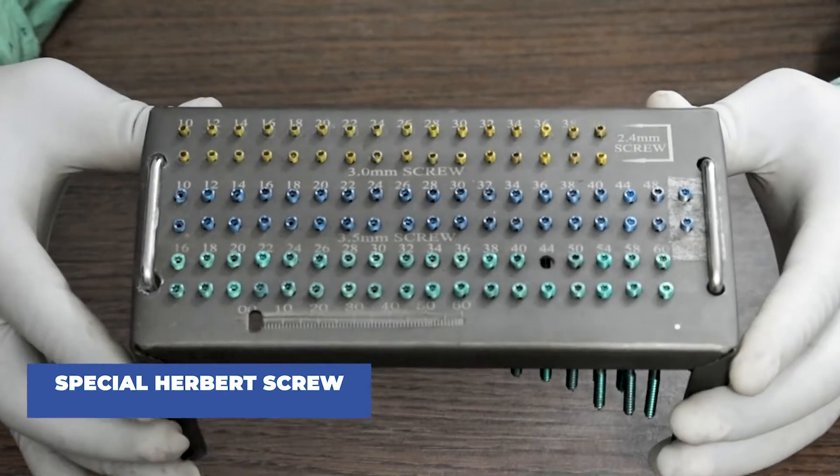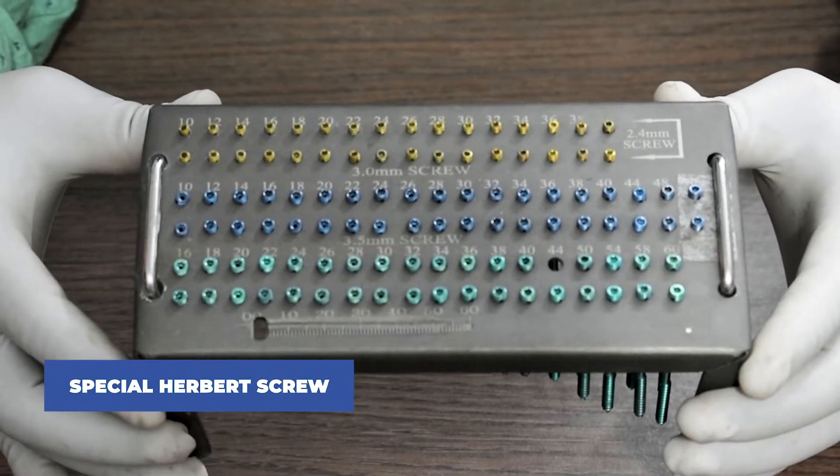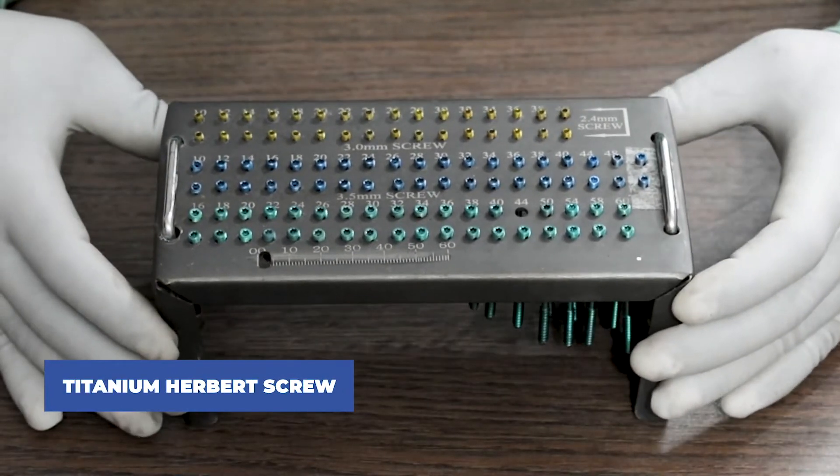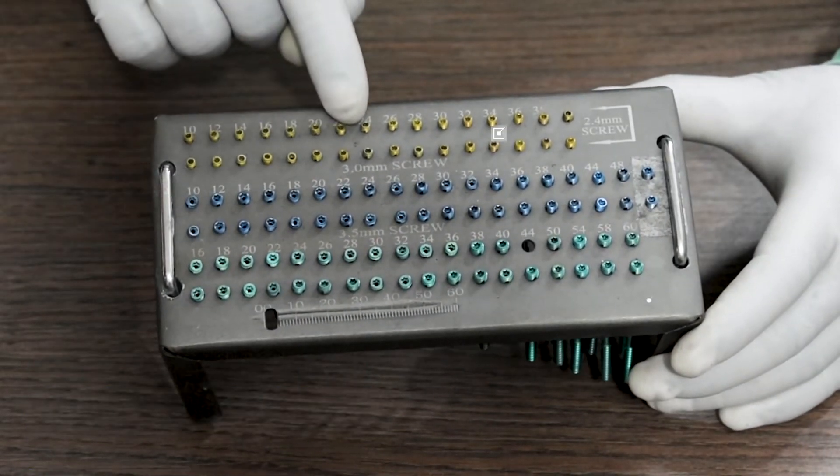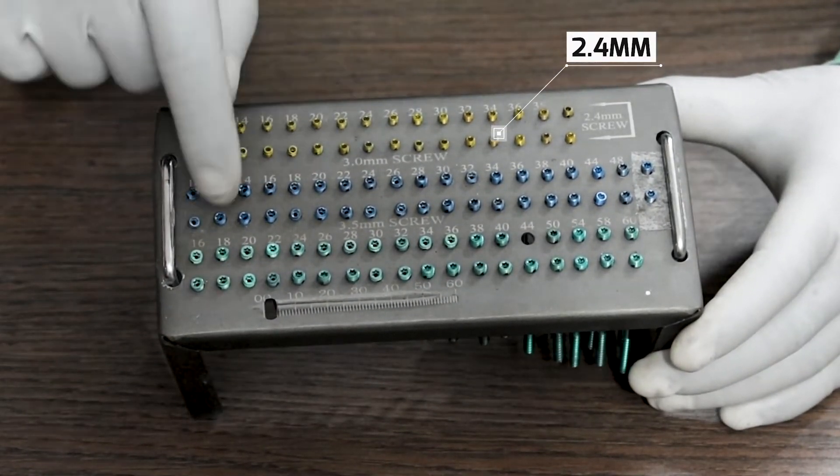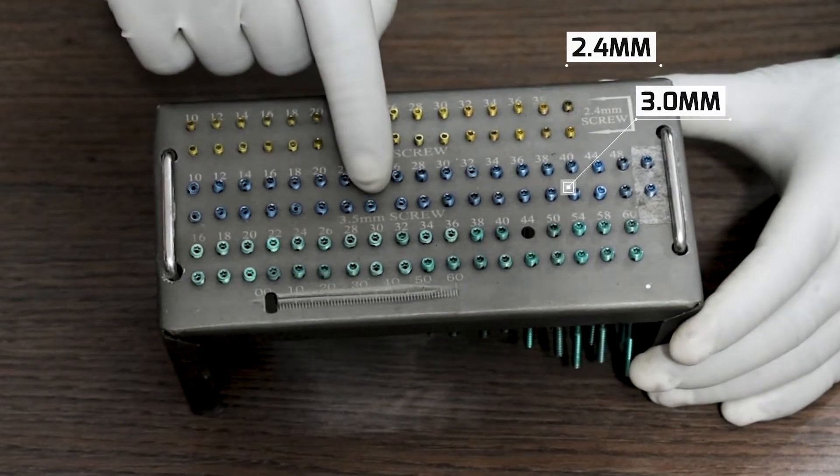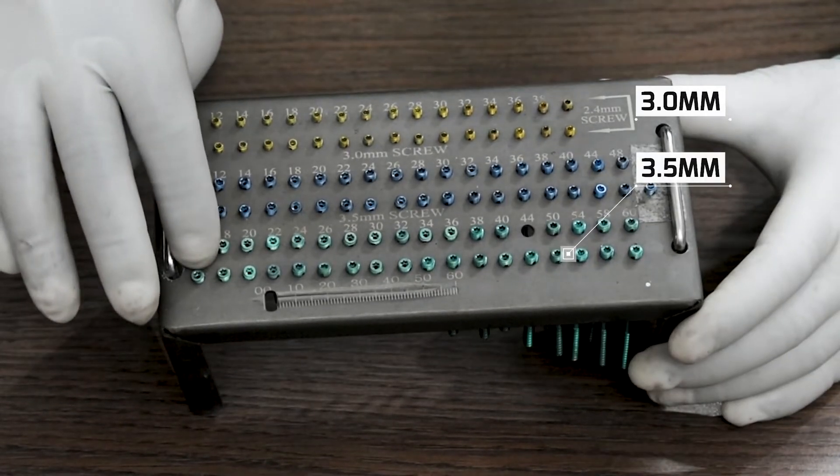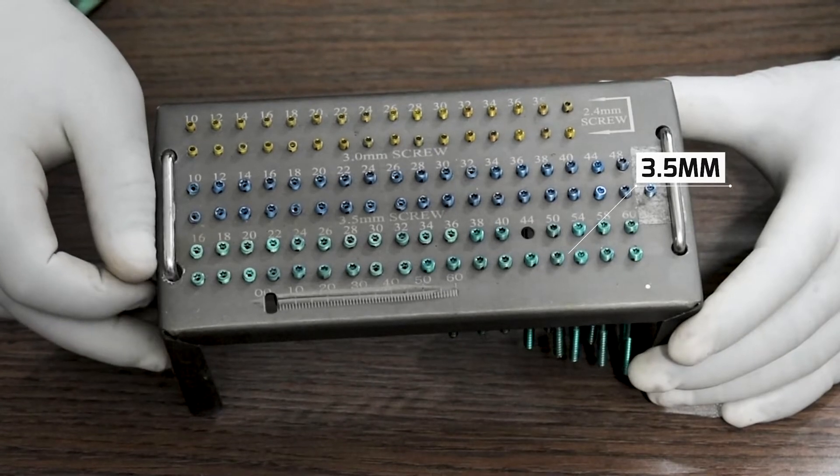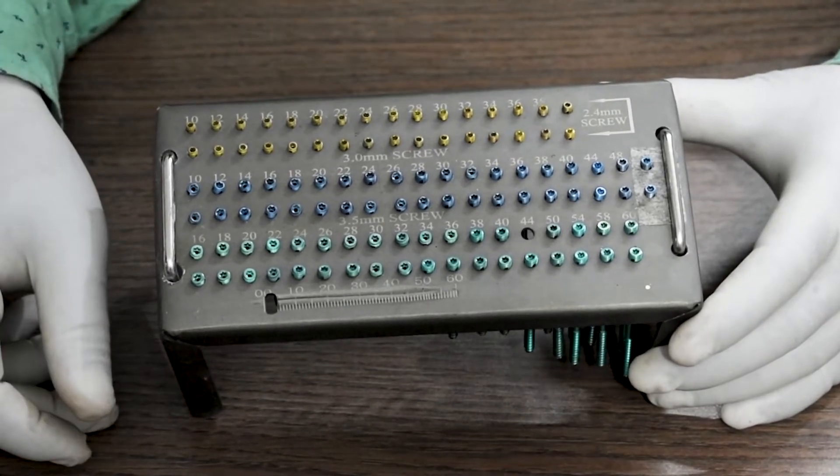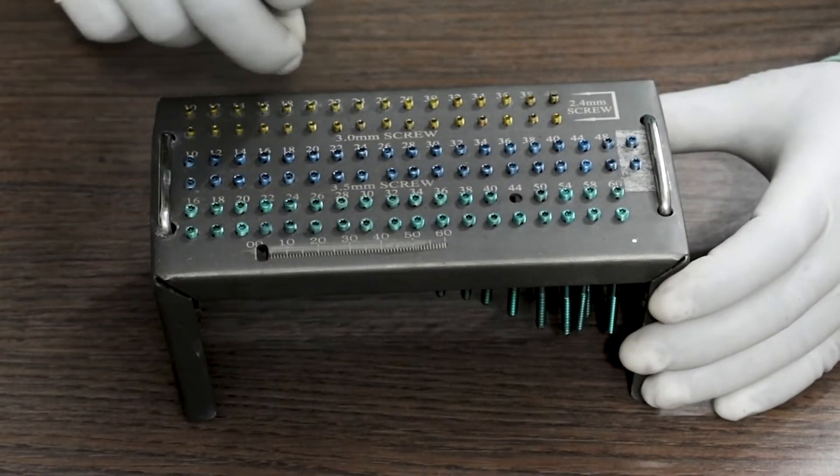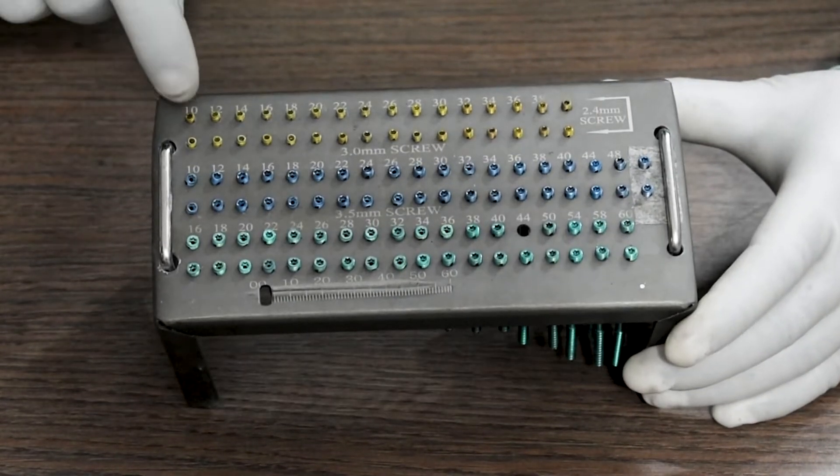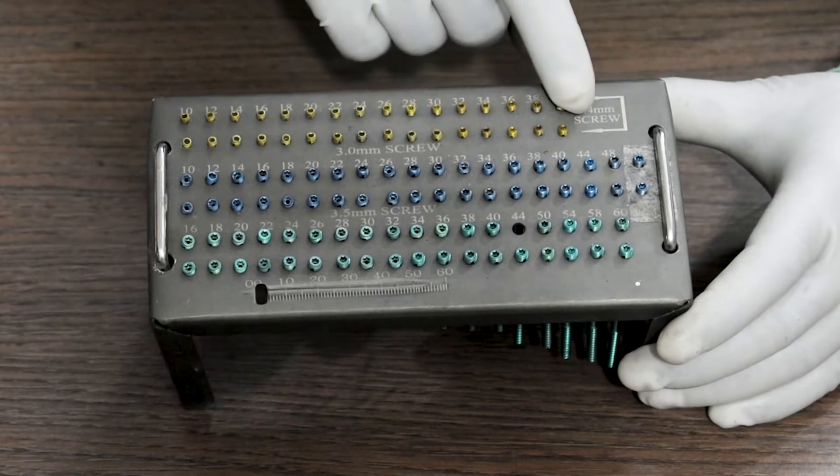This is the Special Herbert Screw. It comes in three sizes. To start with, it is available in 2.4mm diameter, then 3mm and 3.5mm. For 2.4mm, available lengths are from 10mm to 40mm, two pieces each.